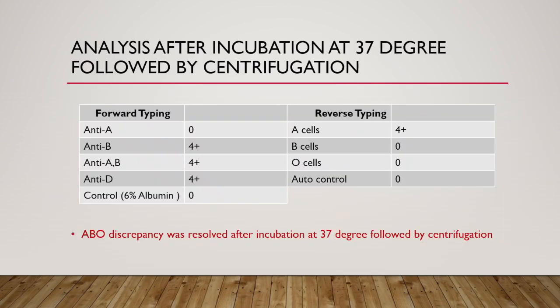These are the results we have obtained after incubation at 37 degrees followed by centrifugation. In reverse typing, we can see that in A cell there is a 4 plus reaction with negative reactions in the remaining B cell, O cell and autocontrol. Hence we can see that the ABO discrepancy was resolved after incubation at 37 degrees followed by centrifugation.